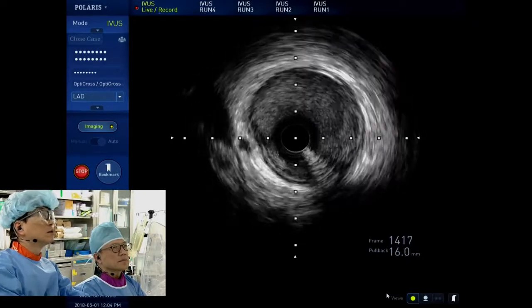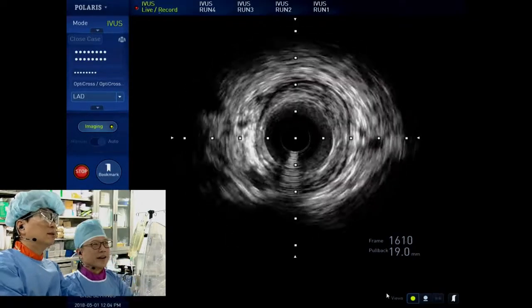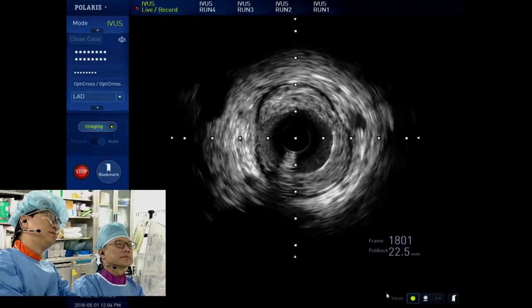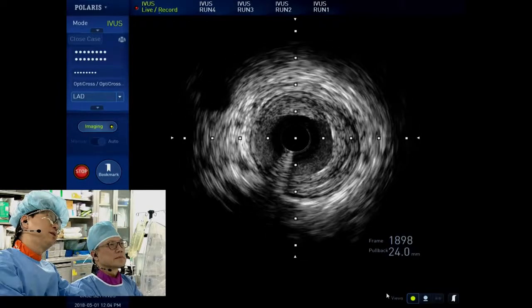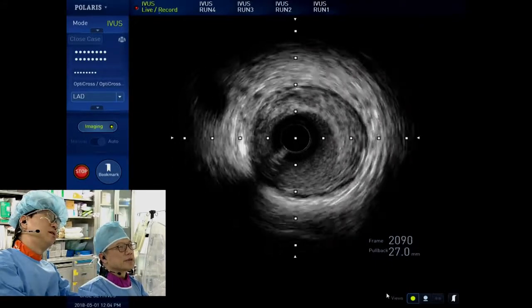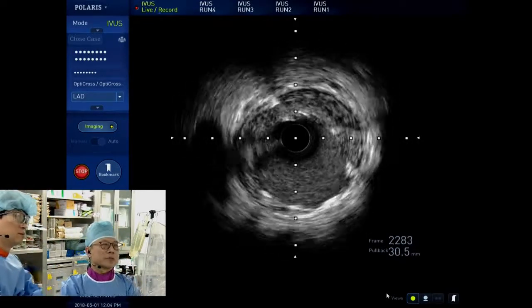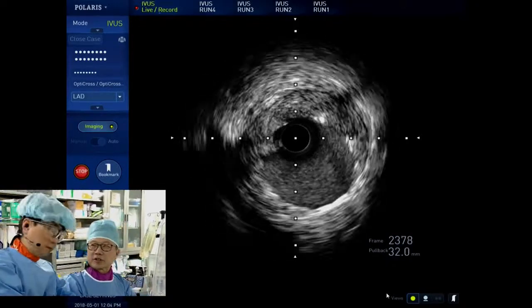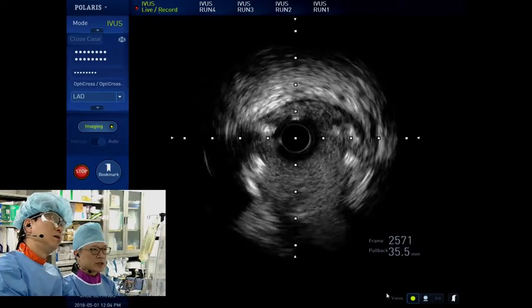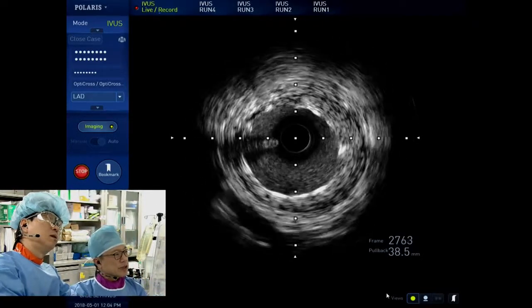Pretty good. And then we'll come to the area probably relatively the smallest of the leftover stuff that we try to avoid stenting. This area. And maybe start from here. That's just plaque, so that's good. We don't want to stent in there. This is a bit more narrow area. Landing zone is good. So acceptable landing area if you don't want to put any more stents in. There's a little bit of plaque, but it's not bad. Actually pretty good diameter there. Obviously proximally would be expected to be underexpanded because of no pre-dilatation and also obviously the bifurcation area.